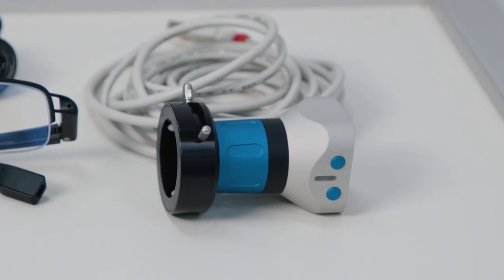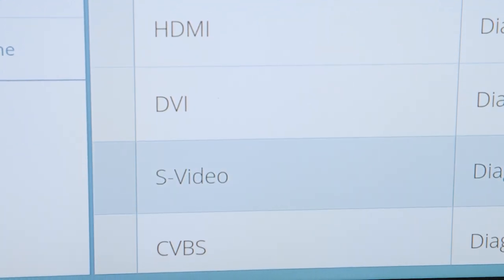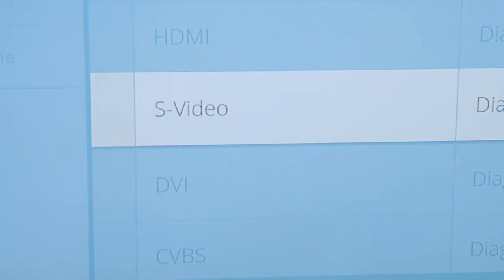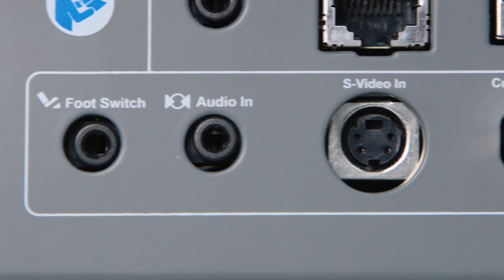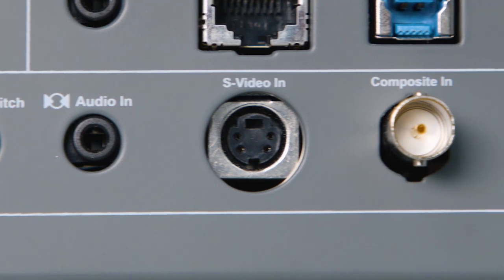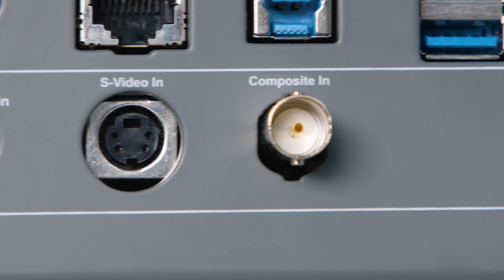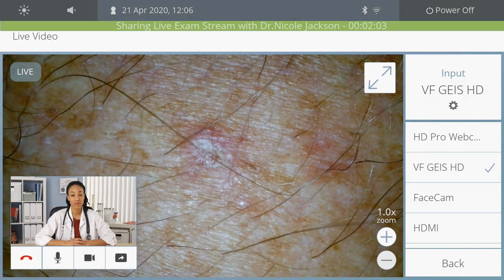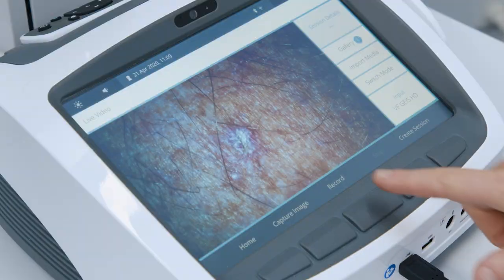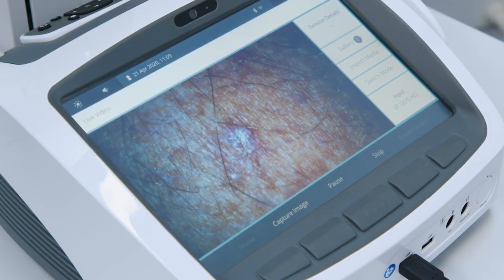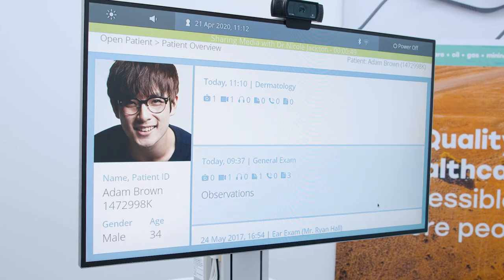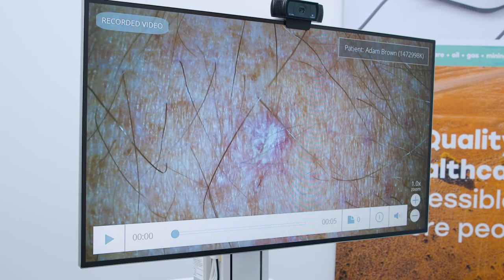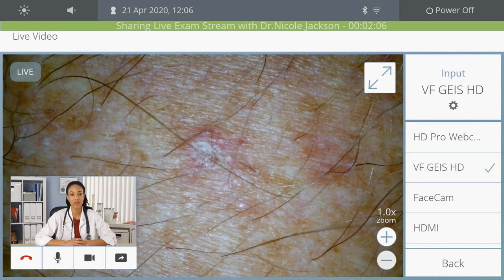These devices can be simply connected by the DVI, HDMI, S-Video, or composite video inputs at the rear of the device. Live feed from any of these peripheral devices can be saved into the patient file and fed through the teleconference link to the far-end doctor.